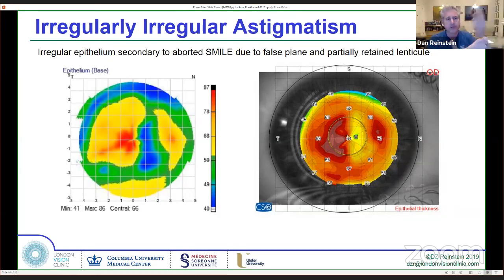I want to be able to test on the same machine and then transfer that difference map in the record, so that I can then move on with a tomographer, topographer, and diagnostic device with all the optics. And we haven't even talked about the work that Jorge Alio has done on the intracorneal segment rings with the AI from Francesco's group. There are just so many applications on this device.